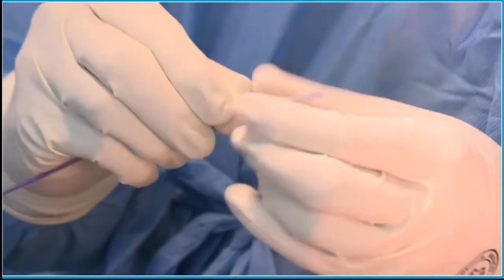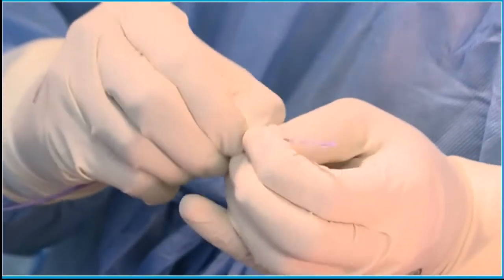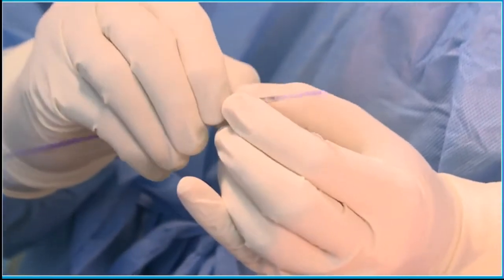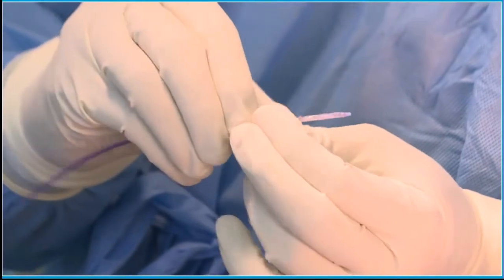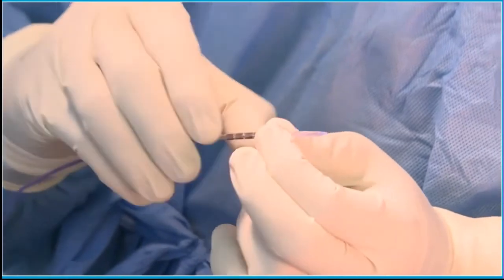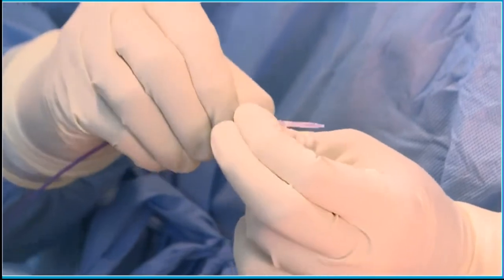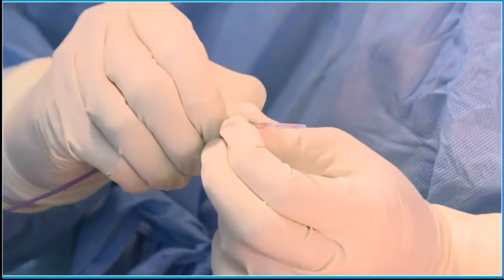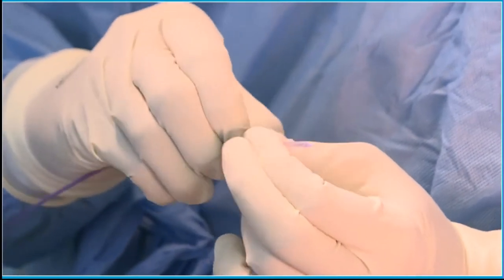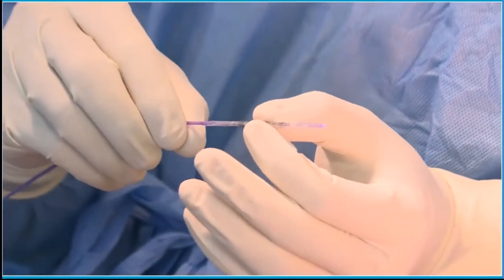The advantage of this particular stent is that what you need is the balloon plus just one French above. So the profile is very thin. In technical terms, it is 200 micron thick. Whatever be the balloon size, this is a 12 Admiral Xtreme, and if I take one French extra, that is enough. See that I'm using my finger to crimp it. And now I'm moving it, it's fixed nicely.